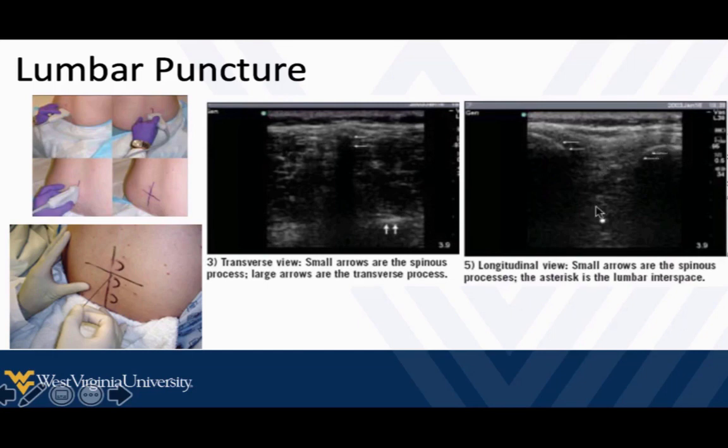Then we line up two spinous processes, find our space, line that up, and mark it with a horizontal line. At that point we should be able to put the probe down, prep, and successfully perform the procedure. Once I've marked it, I generally aim a little bit on the low side and then work my way up towards that spinous process.